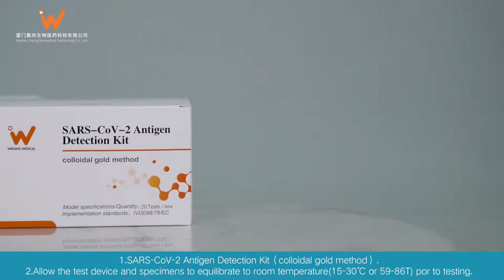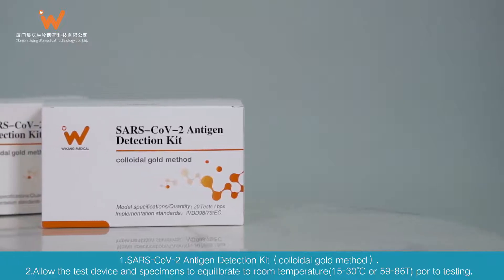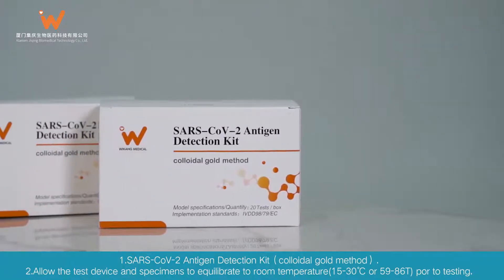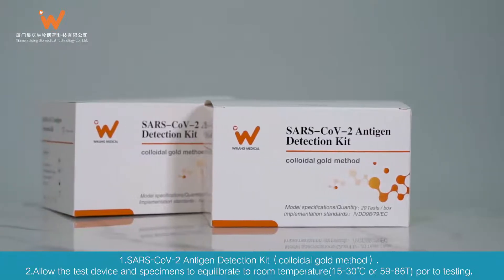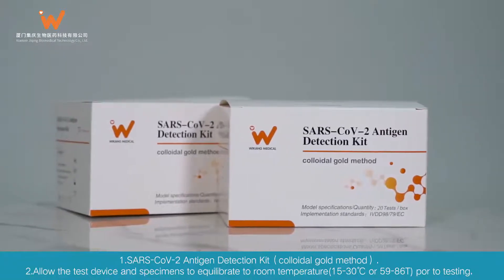SARS-CoV-2 Antigen Detection Kit, Colloidal Gold Method. Allow the test device and specimens to equilibrate to room temperature, 15 to 30 degrees Celsius, or 59 to 86 degrees Fahrenheit, prior to testing.